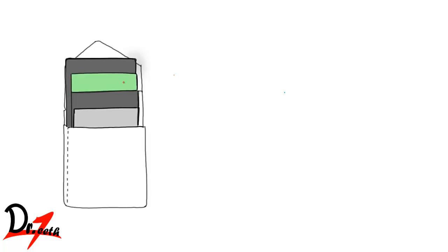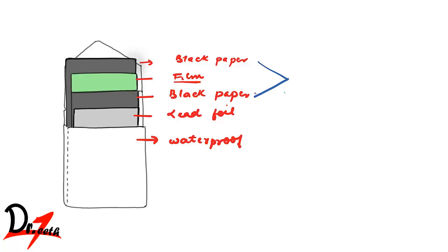So this is how our x-ray film looks from inside. So this is the outer covering, which is waterproof. And then we have the lead foil. And then we have this black paper. And then we have this film. And then once again, we have a black paper. So the black paper doesn't allow light leakage. Because if the light leaks, it will expose the film. And we won't get the image we want.